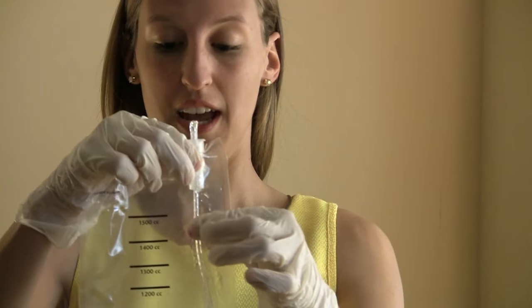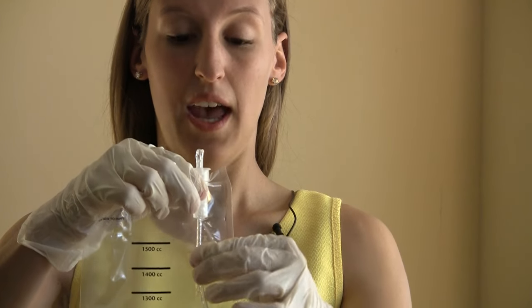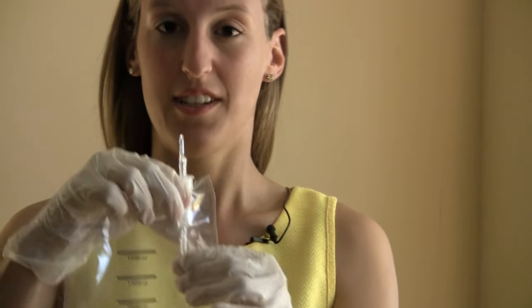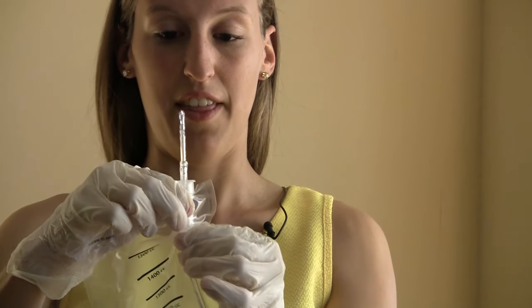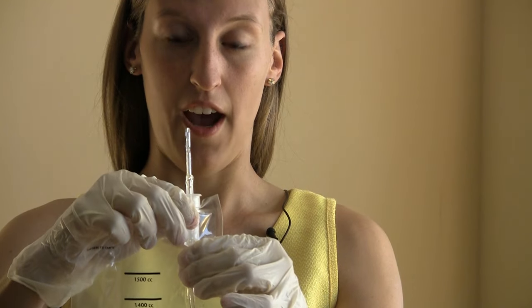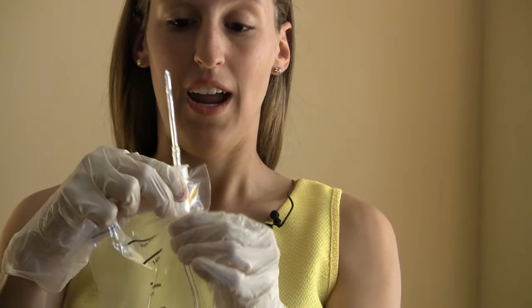Now I'm going to show you how to advance the catheter as you're catheterizing. You place your hand at the 1400 cc's and push up one inch at a time. As you can see it's really easy. The catheter starts coming out of the bag all lubricated and ready to go, and it doesn't come out which is really cool because then you don't have to worry about if the urine is going to come out or if anything is going to get on your clothes.